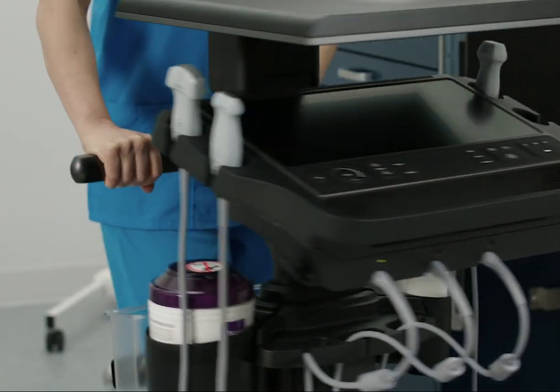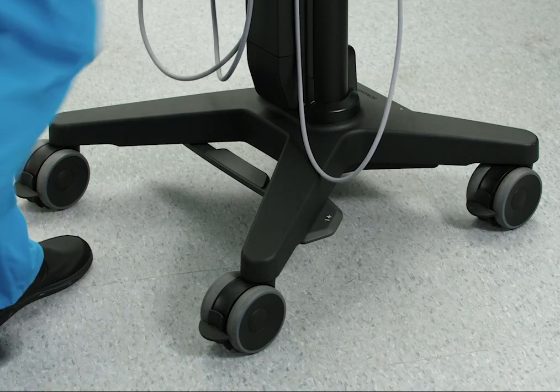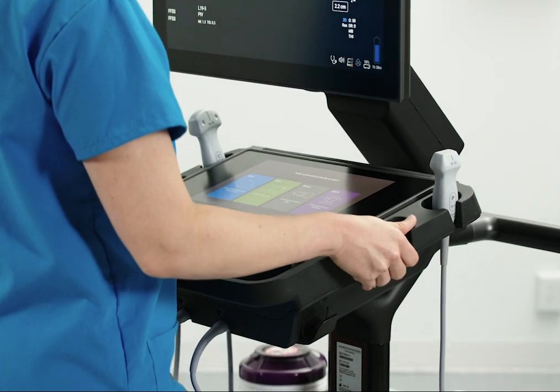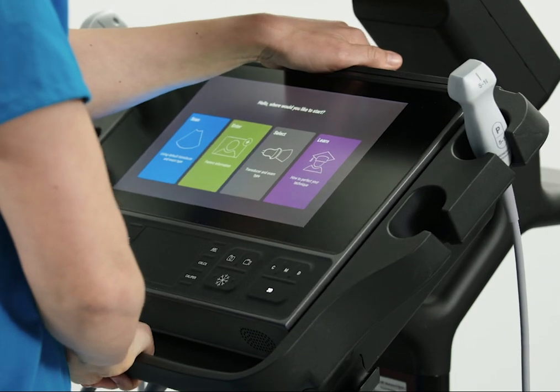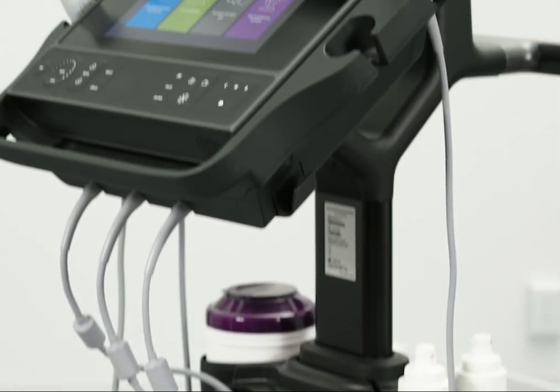You can move the system by pushing or pulling the handle on the back. Adjust the height by stepping on the pedal and pulling up or pushing down on the platform. You can even change the angle of the platform.